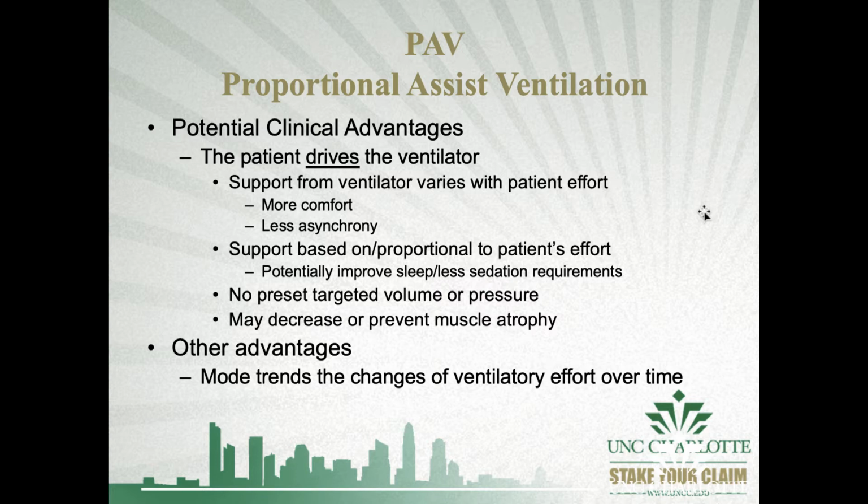Basically, there's been some research that supports that people sleep better when they're on this mode of ventilation. We have less sedation, which I think is obvious. If you make someone more comfortable, make someone more synchronous with the ventilator, you don't have deficits in either one of those areas. And it also keeps those respiratory muscles working despite the augmented pressure support.